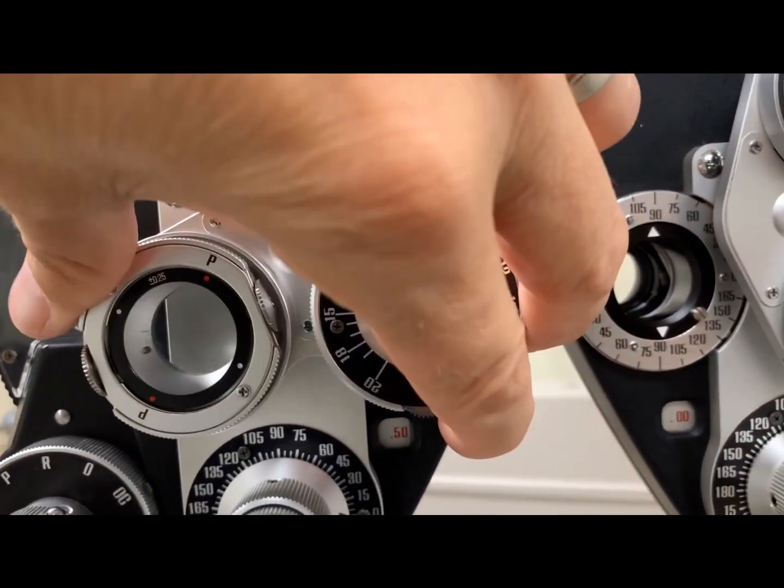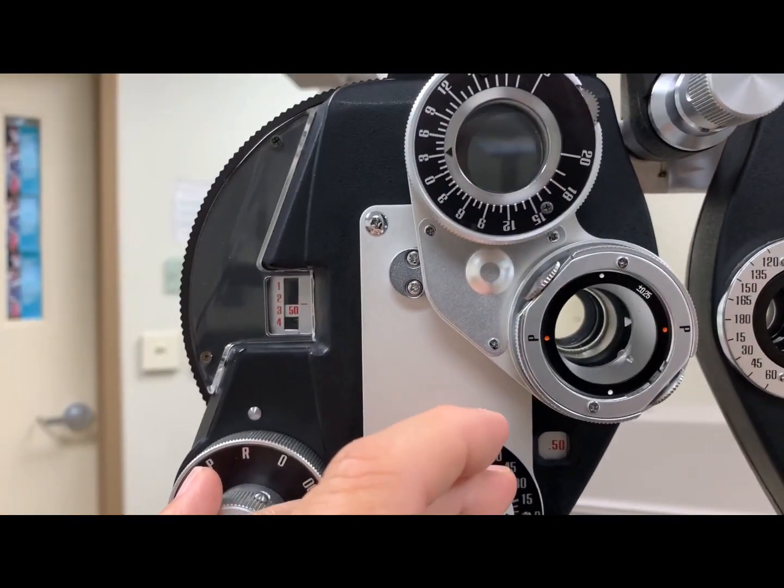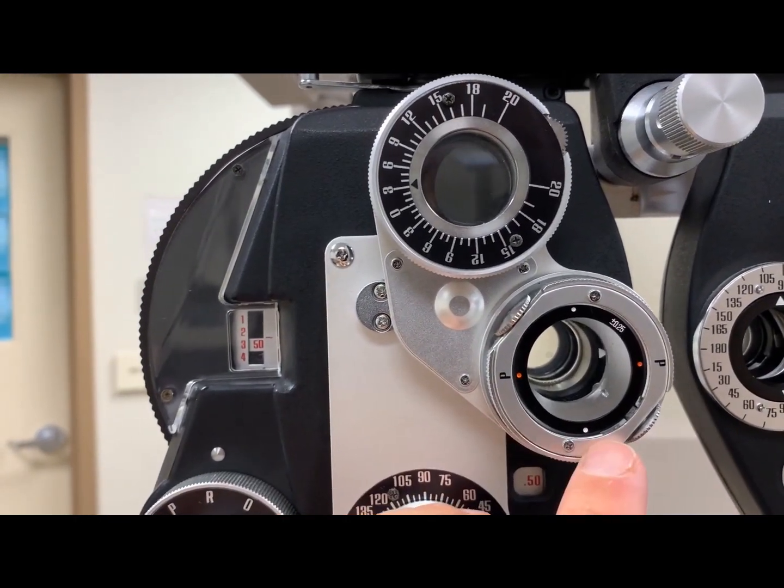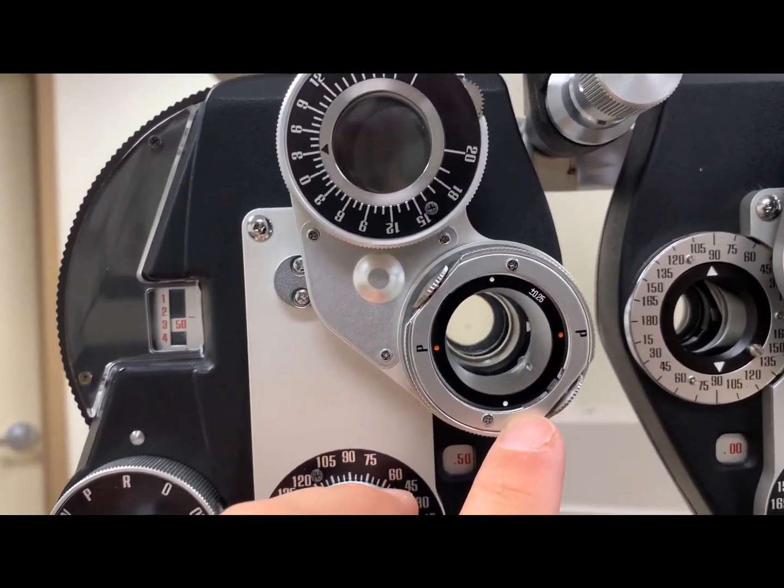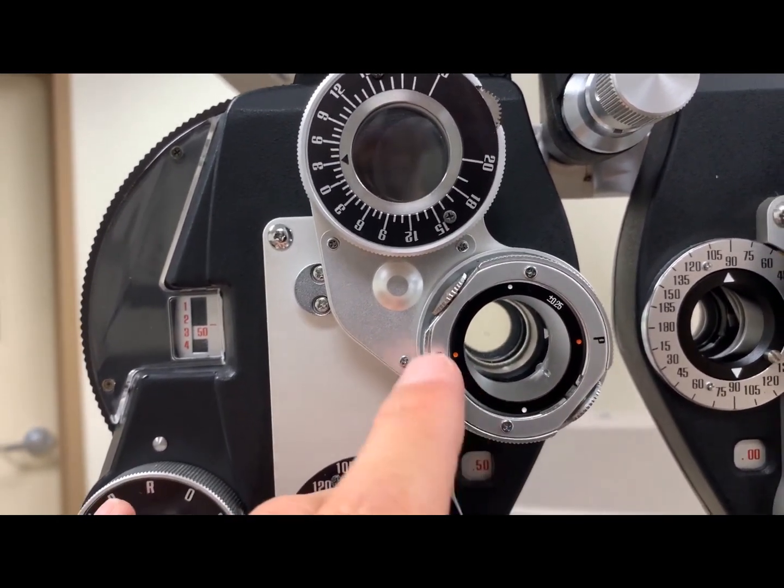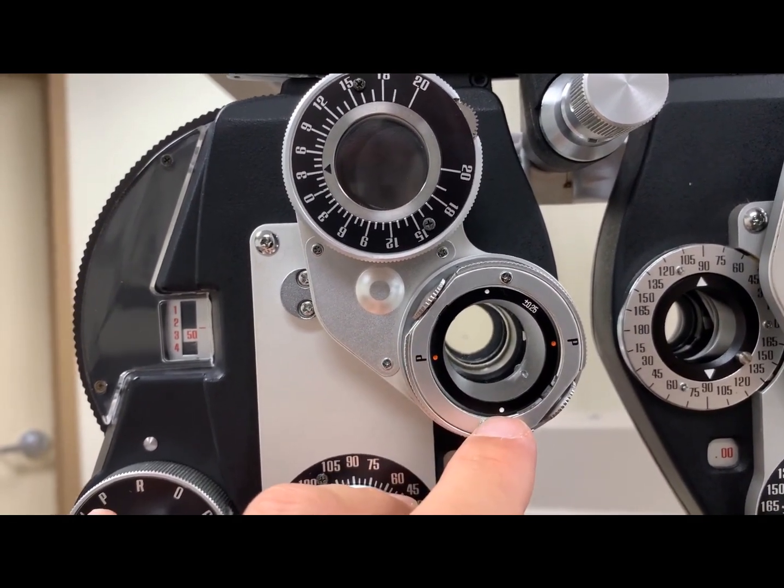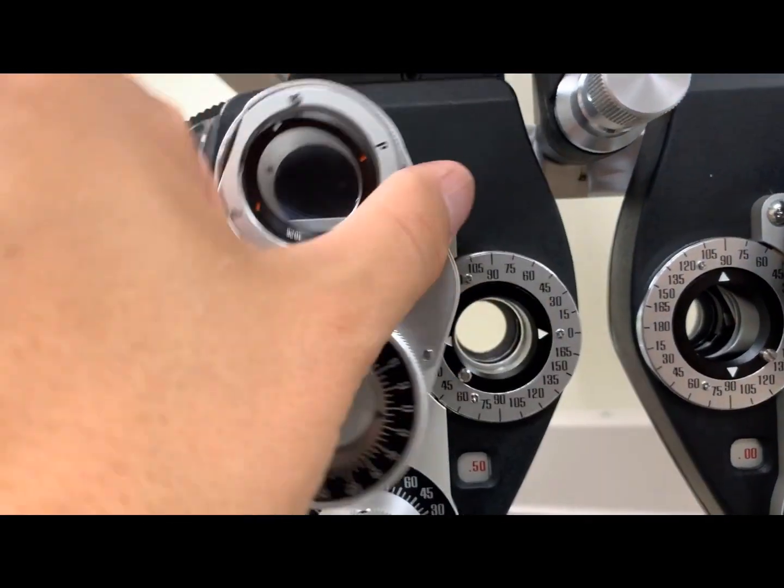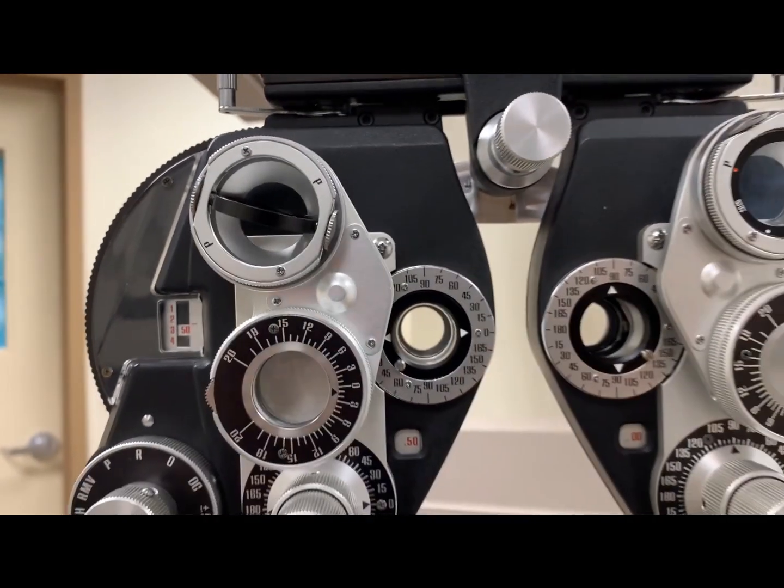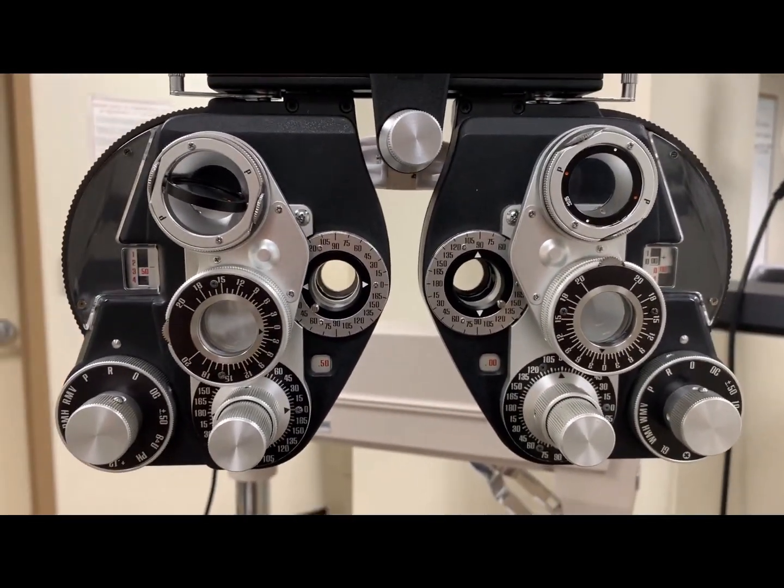The JCC lens is going to be this set of lenses, and we'll learn more about this as the term goes on. But the JCC lens is going to have the P with the red and the white indicators. And that concludes the introduction to the phoropter.